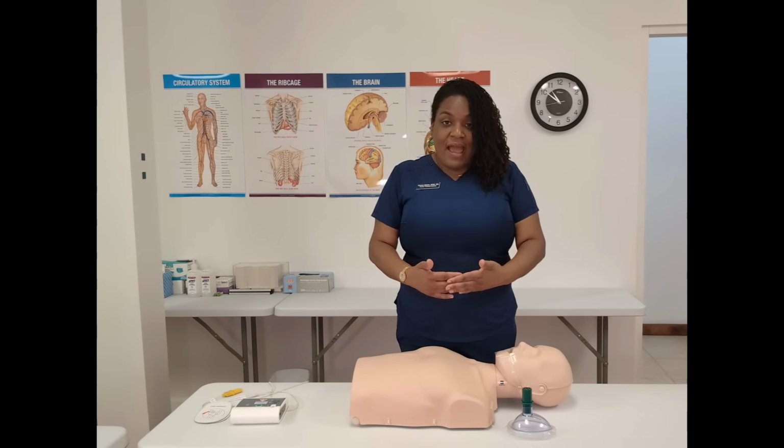What you don't want to do is hyperinflate the chest by giving too much air, because if you give a really big breath, you can actually inflate their stomach, and of course the victim would vomit, and we don't want that happening. So now I'm going to repeat this process, 30 compressions followed by 2 breaths, and I'll continue doing this until help arrives, until I'm exhausted, or until the AED arrives to the scene. So let's do a couple of cycles first, and then we'll utilize our AED.